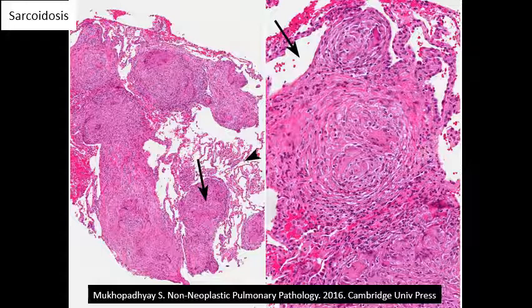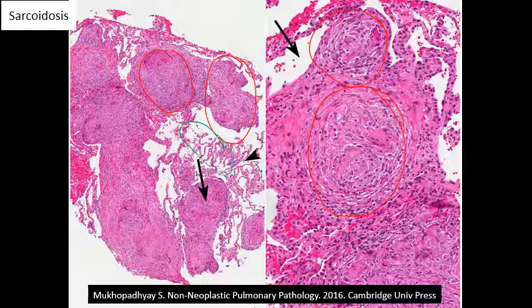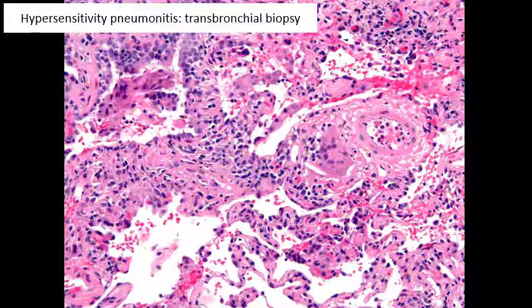In contrast, here is a picture of sarcoidosis — the granulomas are much bigger and more prominent. There's a fairly large prominent granuloma, also in the interstitium like hypersensitivity pneumonitis, but bigger and more prominent. Importantly, the lung parenchyma away from the granulomas is fairly normal in sarcoidosis — not inflamed like in hypersensitivity pneumonitis. Although both diseases have interstitial granulomas, the histologic appearance is quite dramatically different in most cases.